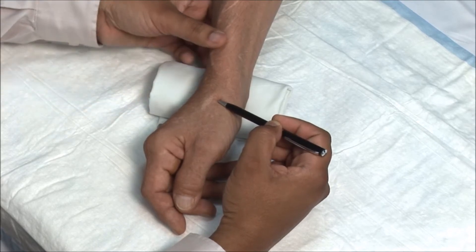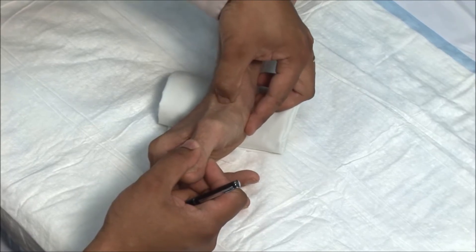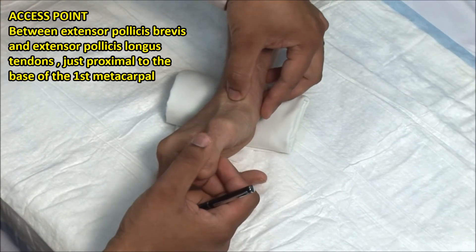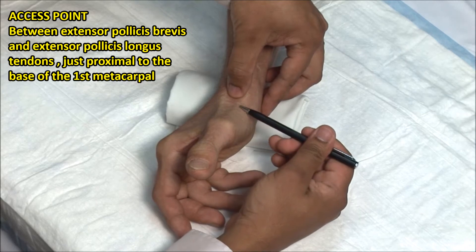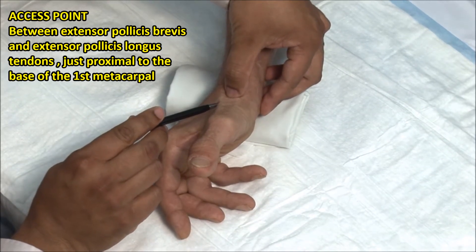The snuff box can be brought out by having the patient extend the thumb against resistance. The point of injection is between the extensor pollicis brevis and extensor pollicis longus tendons, just at the joint space.